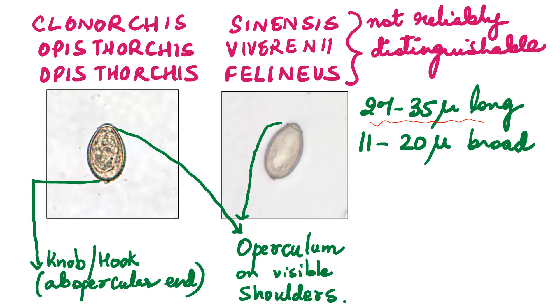Look at this egg in detail carefully. You can see the operculum is placed on shoulders, like our head is placed on shoulders. The operculum is supported by visible shoulders, and on the ab-opercular end there is a knob or a hook. Summary: Clonorchis and Opisthorchis produce small-sized eggs, just 27 to 35 microns. The operculum has visible shoulders beneath it and the ab-opercular end has a knob or a hook.